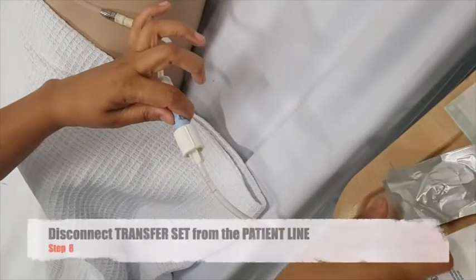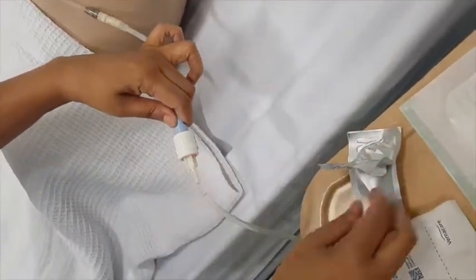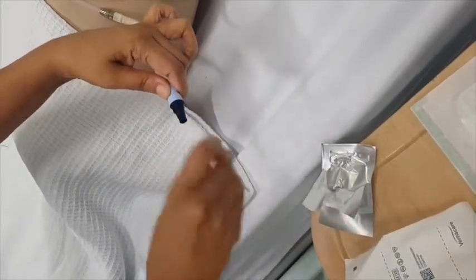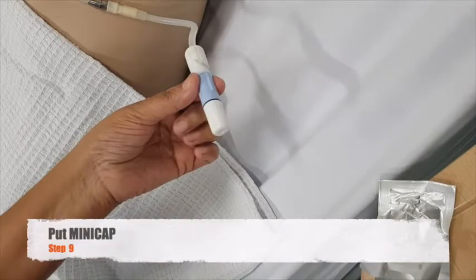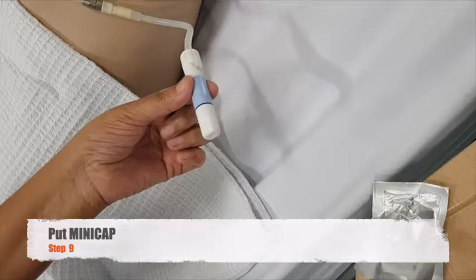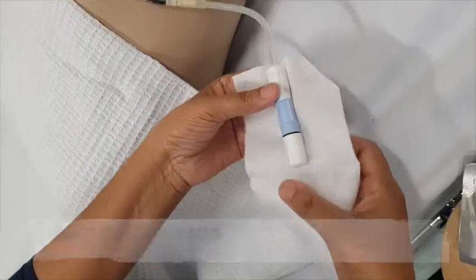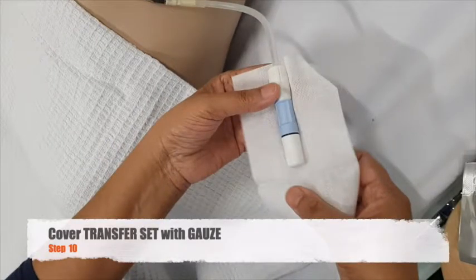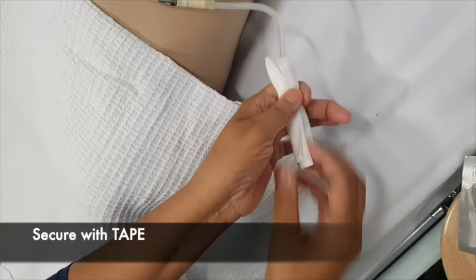Next, proceed to disconnect your patient's transfer set from the patient line. At this point, remember your aseptic non-touch technique. Make sure that your mini-cap is within reach and then put the mini-cap on. Next, proceed to take your sterile gauze and cover your transfer set. Then, secure with two pieces of tape.